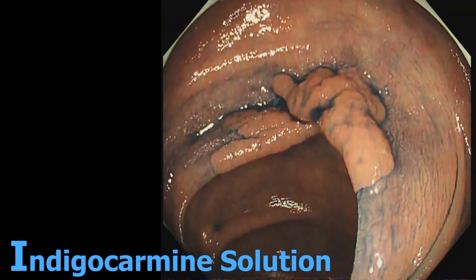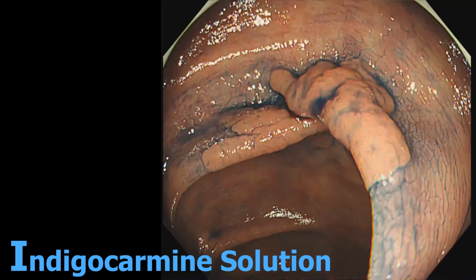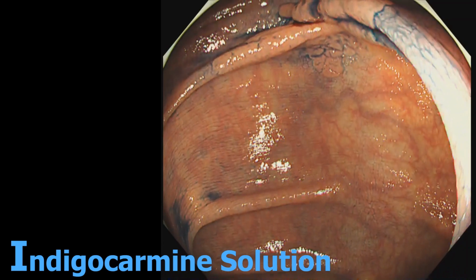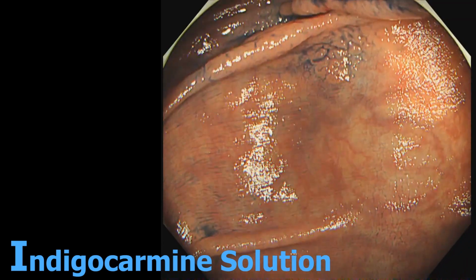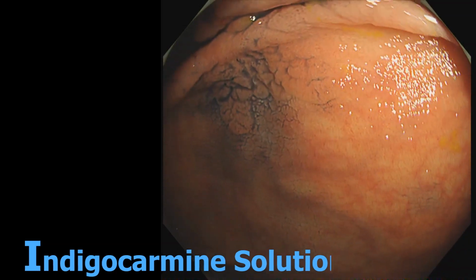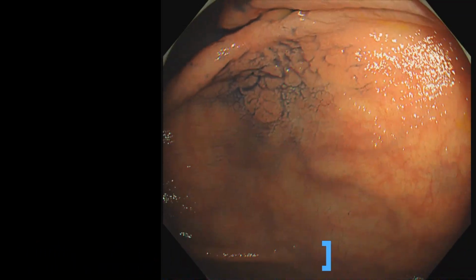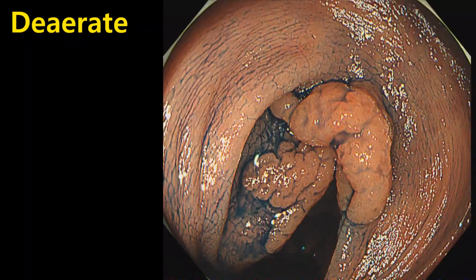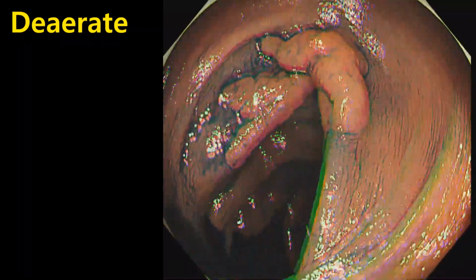Surface pattern is observed by mid-range zoom. Surface pattern is regular, and so the region is diagnosed as JNET 2A. Vessel pattern is observed by full zoom. Vessel pattern is a little irregular, and the region is diagnosed as JNET 2A.